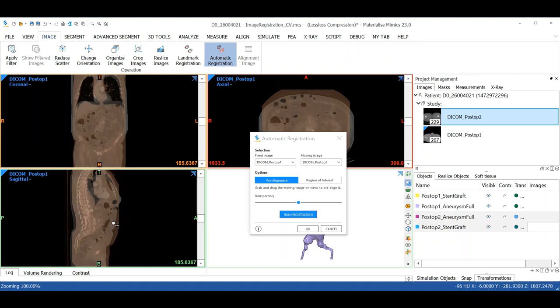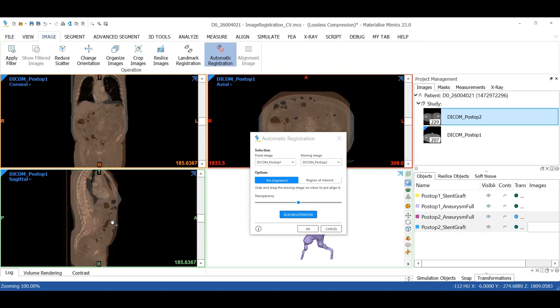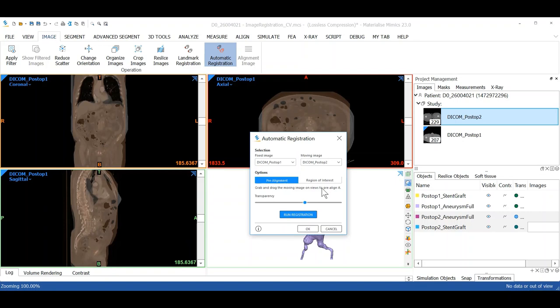Now we can change the transparency to help with the matching or we can even crop the window to only include a particular region of interest. Next, we can run the registration tool.